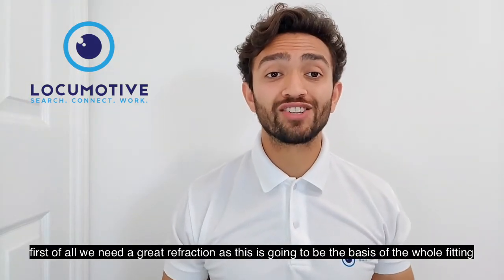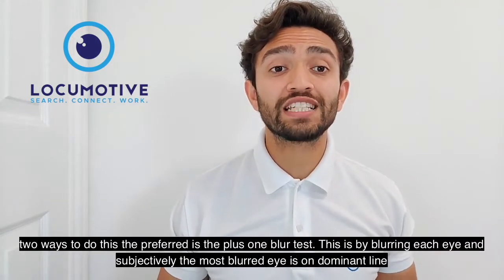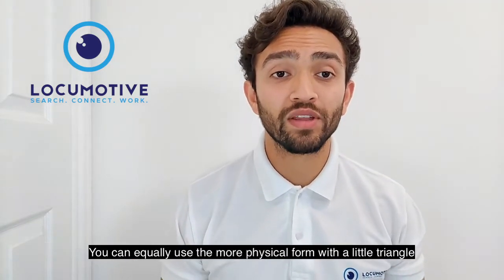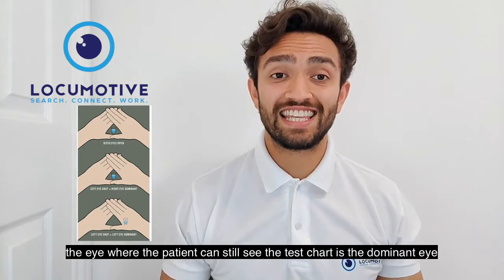First of all we need a great refraction — this is going to be the basis of the whole fitting. Then we're going to calculate our dominant eye. There are two ways to do this. The preferred is the plus one blur test: by blurring each eye, subjectively the most blurred eye is our dominant eye. You can equally use the more physical form with a little triangle, where the eye through which the patient can still see the test chart is the dominant eye.